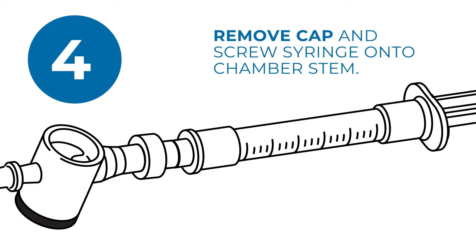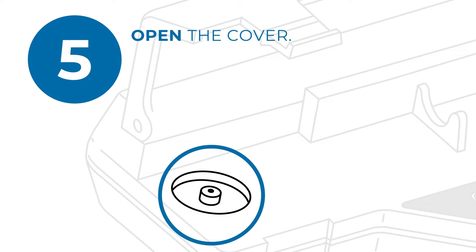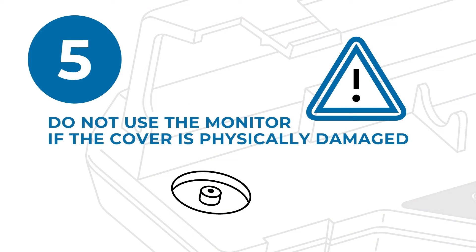Be sure not to contaminate the fluid pathway. Open the cover and inspect the transducer port for damage or contamination. Do not use the monitor if the cover is physically damaged or unable to snap shut.